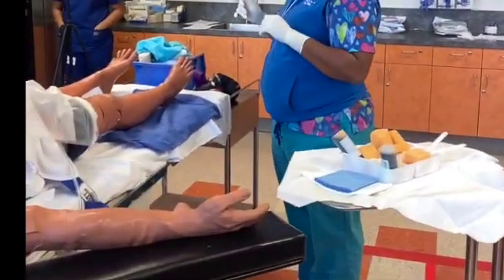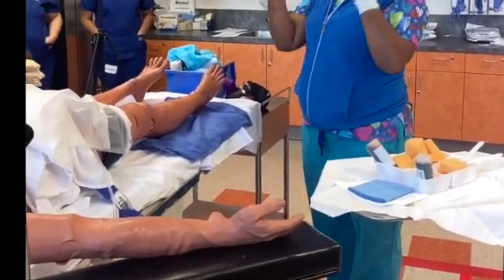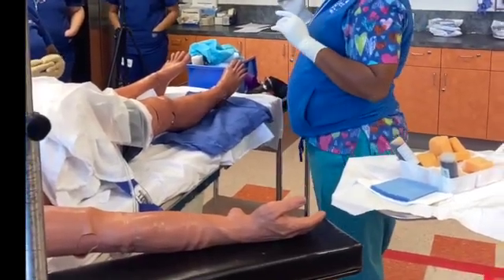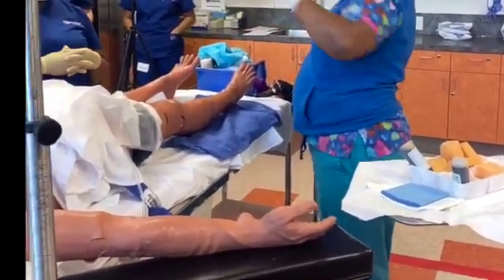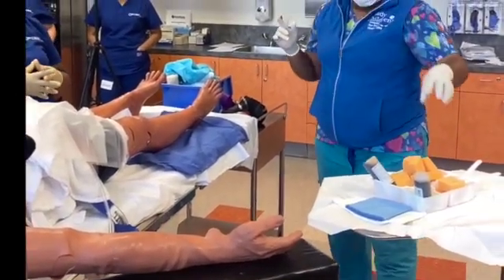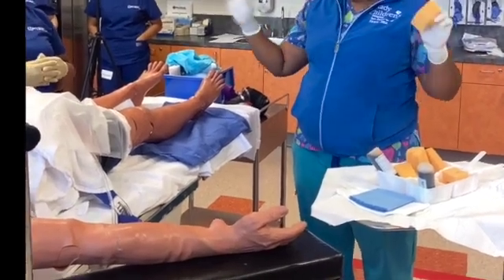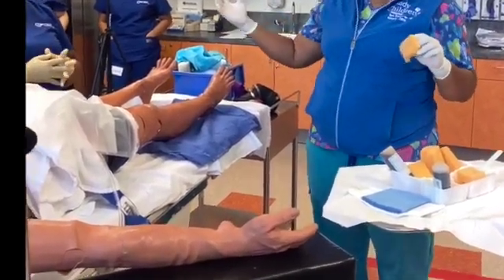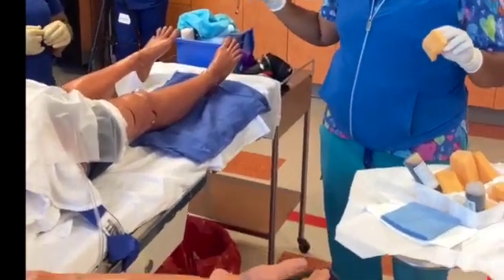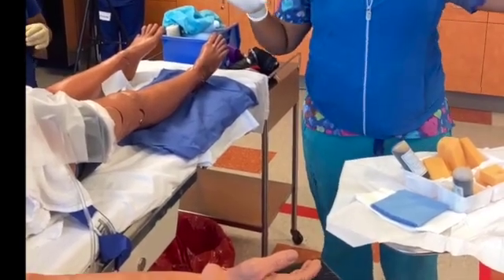The leg is placed in the holder if applicable. Don sterile gloves. Covers tourniquet cup with surgical towel secured with plastic adhesive drape. Which we've already done in the last one, so we're good. Uses no touch technique with prep sponges secured in sponge forceps or used commercial prep applicator. So there's a lot of ways you can do this. A lot of times we'll raise the leg up first. But let's say Bree's like, man, my back hurts. So I'll wait till the last minute to have her pick up that leg. Okay?